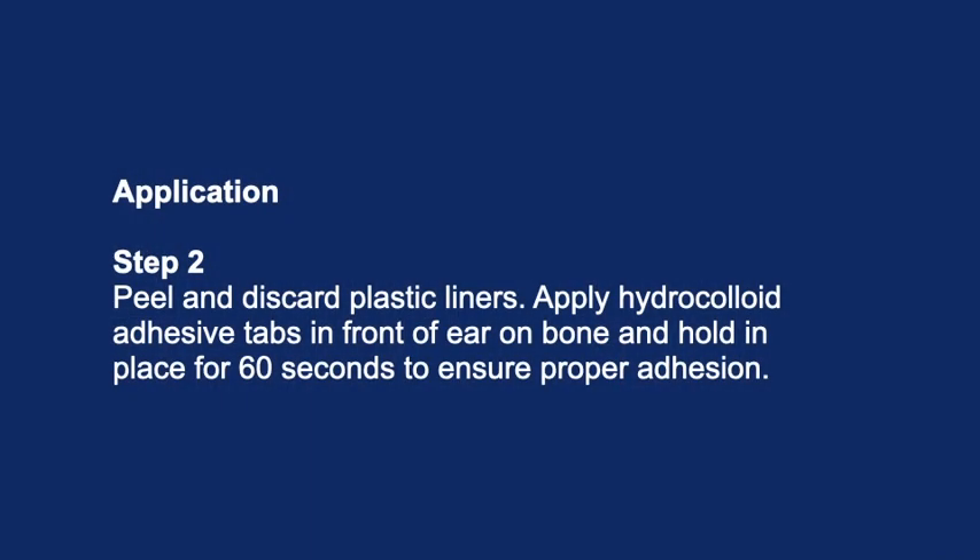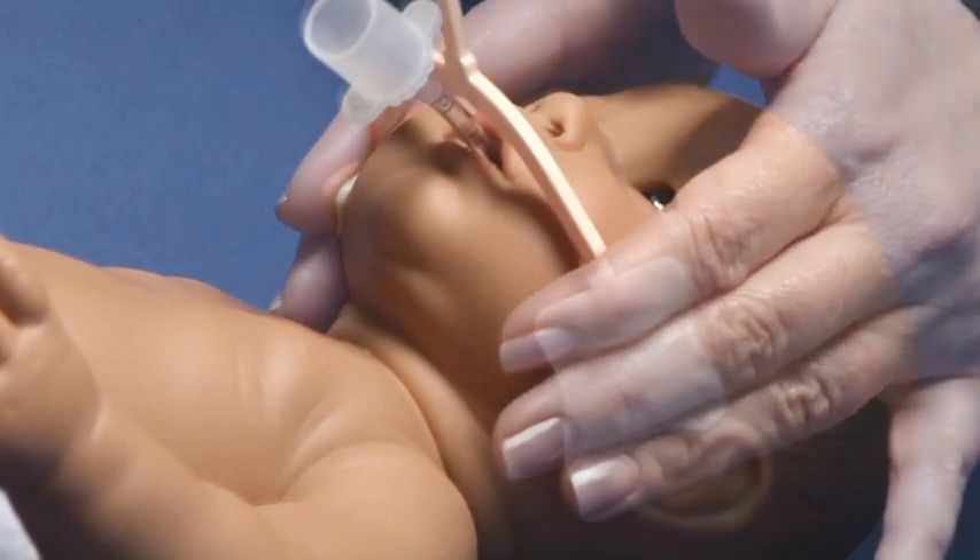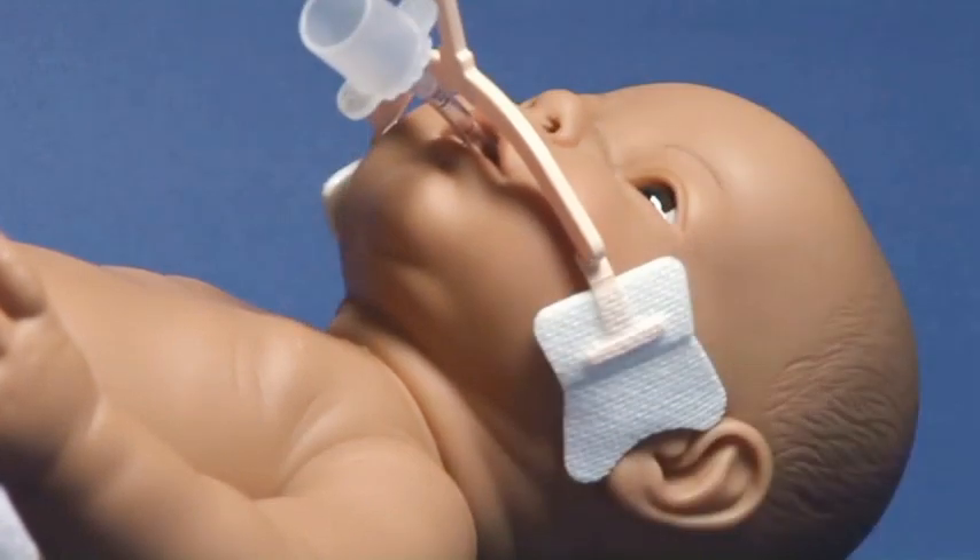Application step 2: Peel and discard plastic liners. Apply hydrocolloid adhesive tabs in front of the ear on the bone and hold in place for 60 seconds to ensure proper adhesion. Note: ensure the ET tube is below the platform to reduce pressure on the palate or gums.